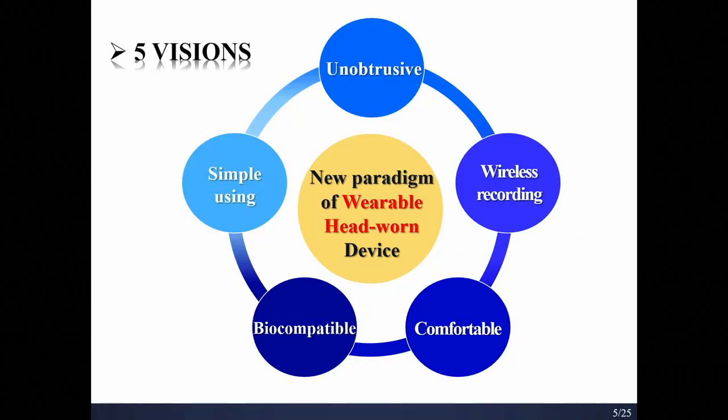So I have developed a new paradigm of wearable head-worn device, such as the EEG device, with 5 different visions. The new device must be simple to use, unobtrusive to wear, wireless for recording, comfortable to wear, and even biocompatible for users.